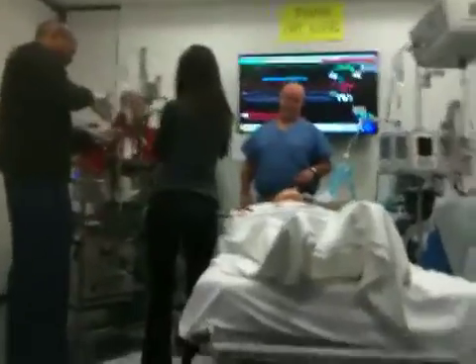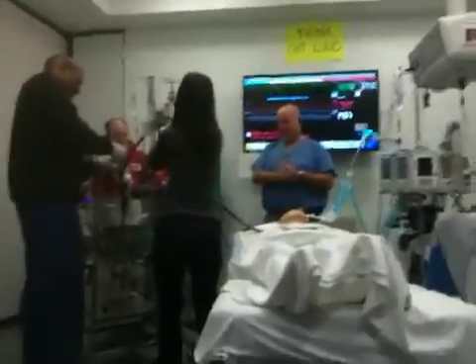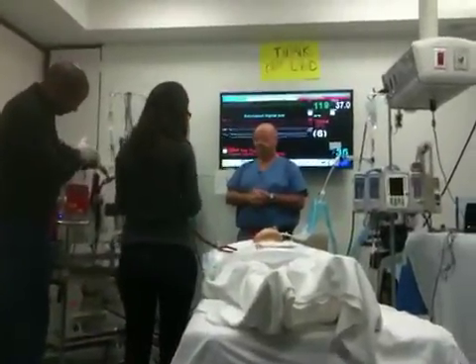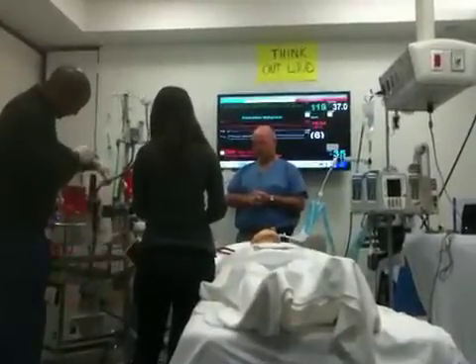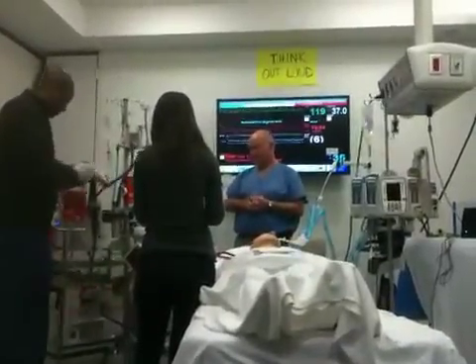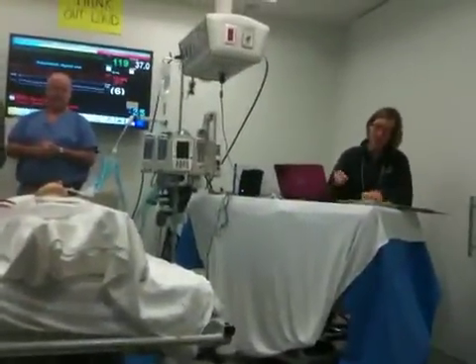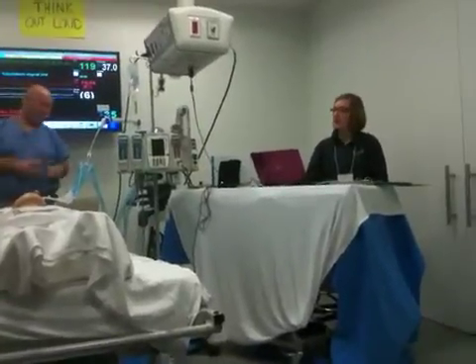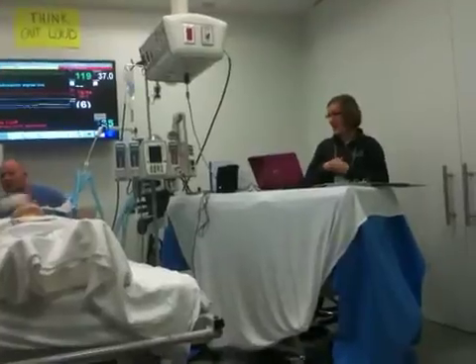Pretty sure everybody's gonna leave here saying they hope they never get air in their circuit. Well, that's what they had mentioned yesterday, but on a different circuit, it's a little bit different manipulating it and getting air out, so we got really good with that yesterday. So, we had to improvise in this room. Everyone else had gone through an arterial air scenario. This was venous air again.